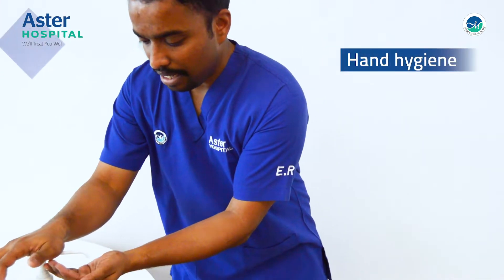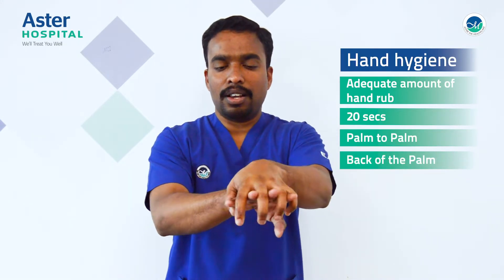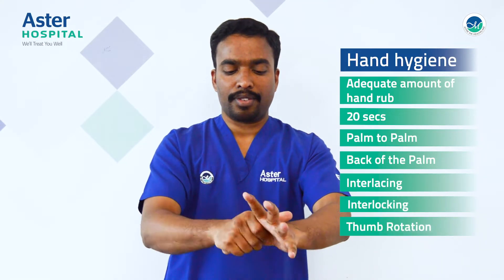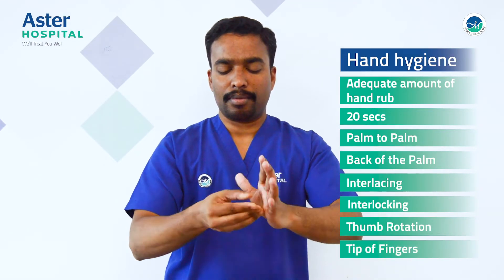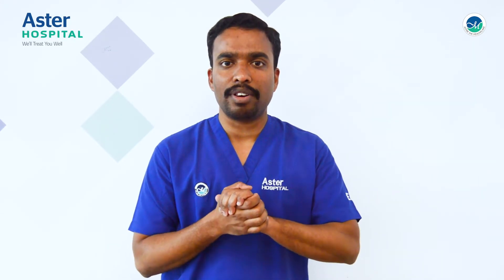Before that, we have to perform hand hygiene. We follow WHO 2009 guidelines: palm to palm, right hand over your left dorsum, vice versa, interlacing, interlocking, thumb rotation, vice versa, fingertips. Once your hands are dry, you are ready to wear a surgical mask.